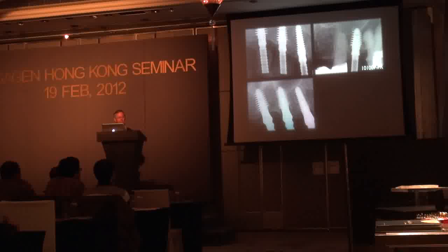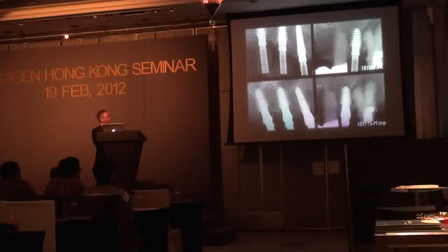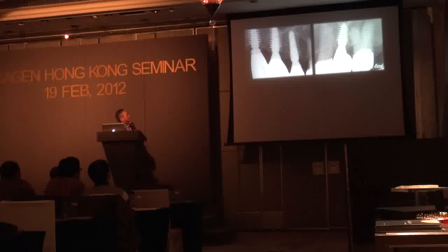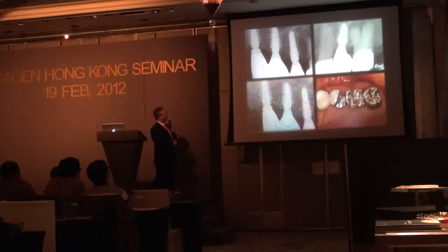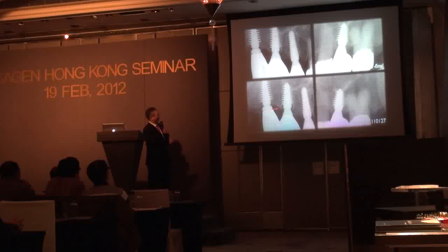Provisional restoration, and took an impression again to finish the restoration. It's very easy to do. So I made a gold crown, cementation time. It's good, and there's no damage on the implant.